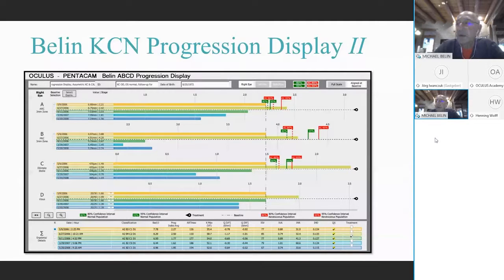I want to start off by why we chose an 80 and 95% confidence intervals. Well, 95% confidence intervals is fairly typical in the medical literature. In other words, the 5% false positive rate. So that's a good comfort level. But 80%, if you have two parameters at the 80% level, that's effectively the same as a single parameter at the 95% level. It equals about 96%. So we list both the 80% and 95% confidence intervals.